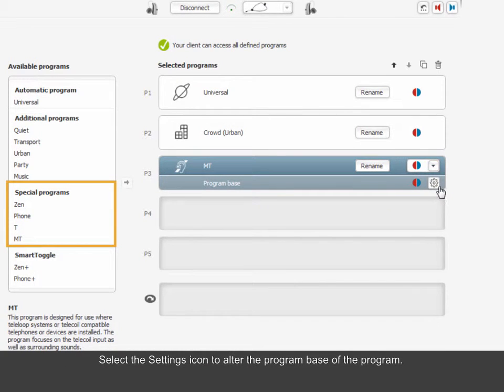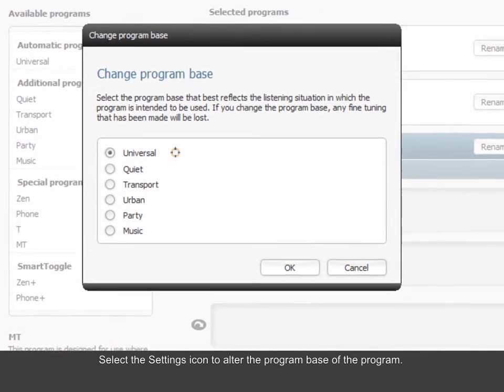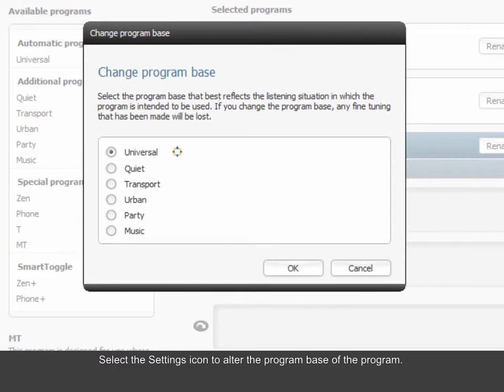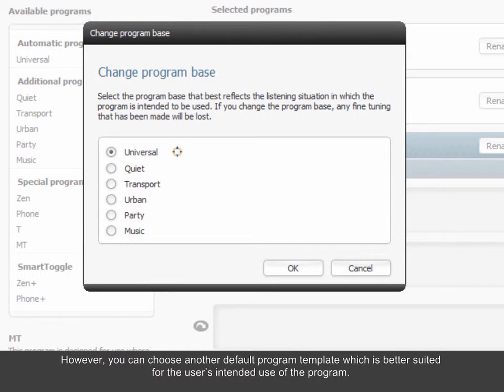Select the Settings icon to alter the program base of the program. The special programs all have a standard default universal program as their default base program. However, you can choose another default program template which is better suited for the user's intended use of the program.